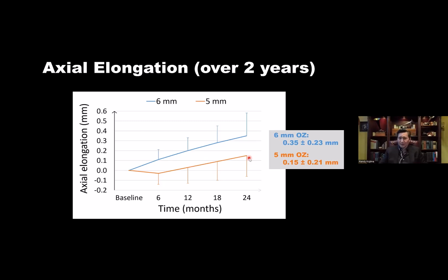Now, this is parallel to some of the research done in combination studies where you have an optical intervention like Ortho-K or soft multifocal plus atropine. Really you can use a smaller optic zone and achieve pretty similar myopia controlling outcomes, again, and not using a pharmacological intervention. So super exciting.